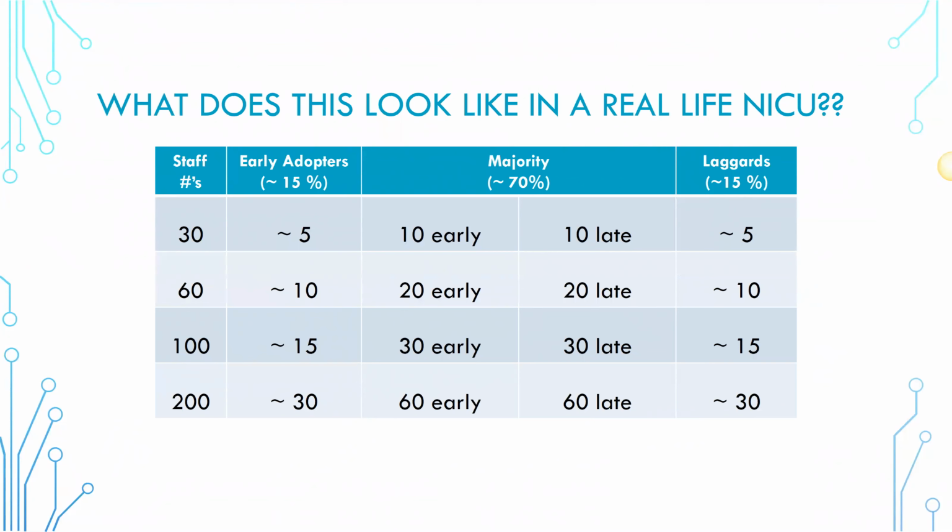You can create cascades in the EMR. So nurses might document if the monitor is in use. They might say what type of monitor, the level of impedance, the microvolt levels. Those are all things that the nurses can assess, the margins. They're not interpreting the pattern per se, but they're certainly telling where the voltage is. And just like every other vital sign, they can report on those kinds of things.